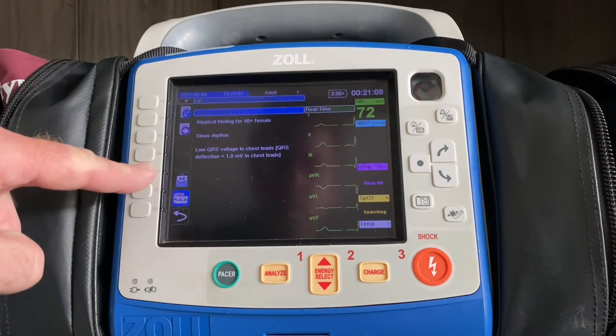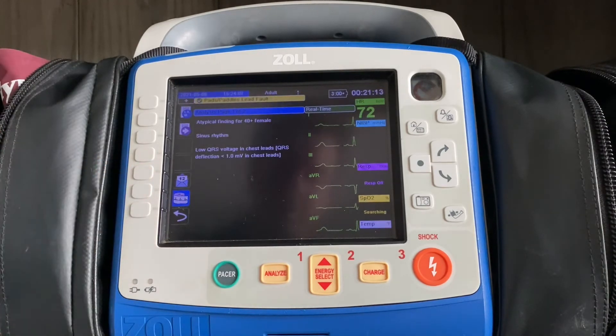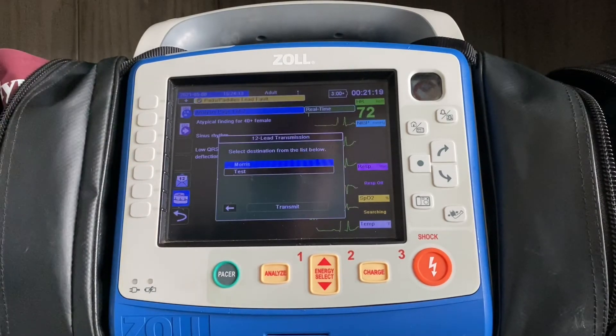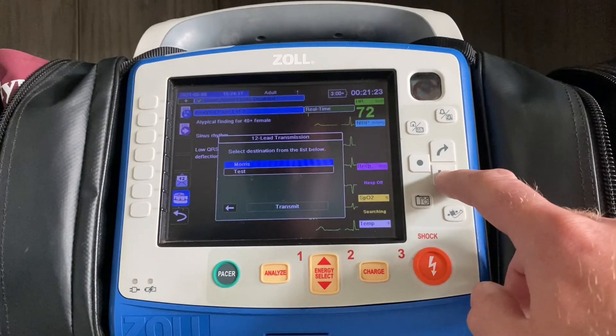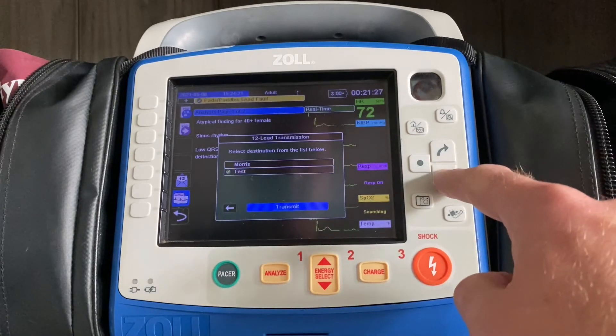You'll then see this white envelope. The idea here is that you're taking this 12-lead, packaging it up in an envelope, and sending it off to the hospital. So we hit the 12-lead button, we pick out what hospital we want to go to, and then we go down and hit transmit.